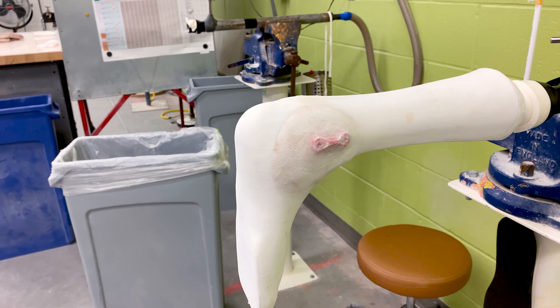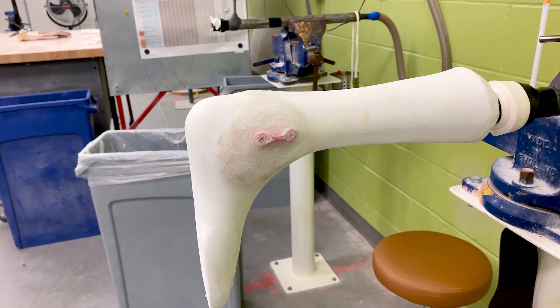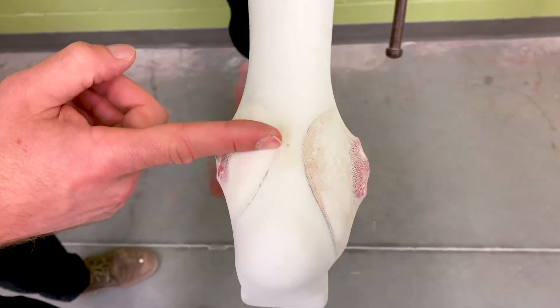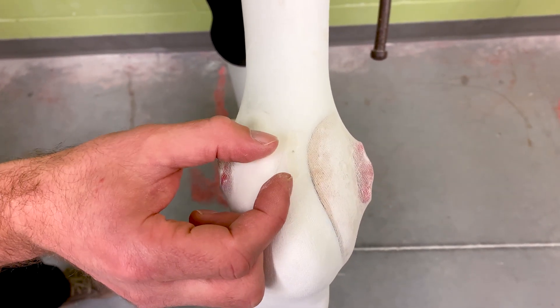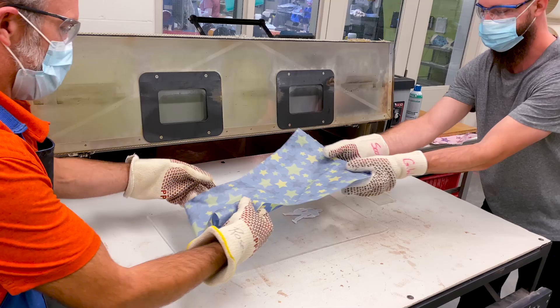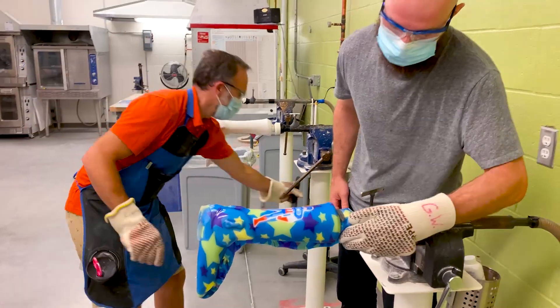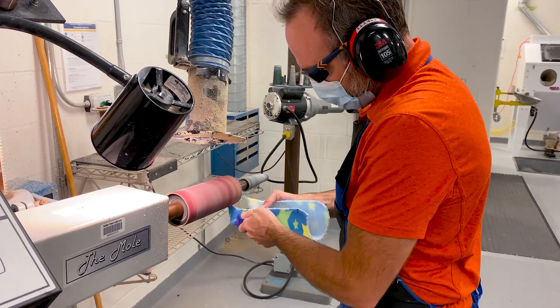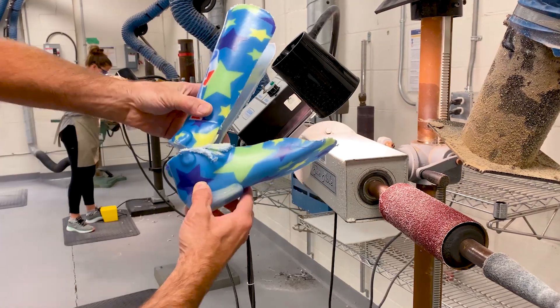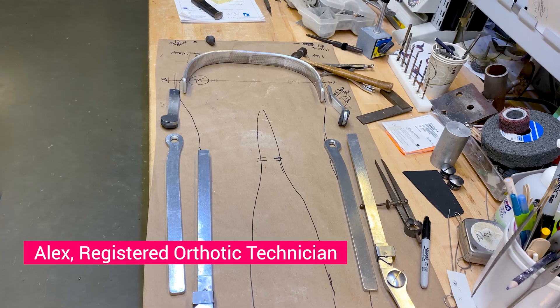First, the ankle-foot orthosis is made. This plaster cast looks different because this will be an articulated AFO, meaning there'll be a hinge that allows the patient to bend their ankle when walking. Next, Matt creates the ankle joint by cutting and shaping the plastic. Then it's over to Alex, who's working on the hip and knee parts of the brace.